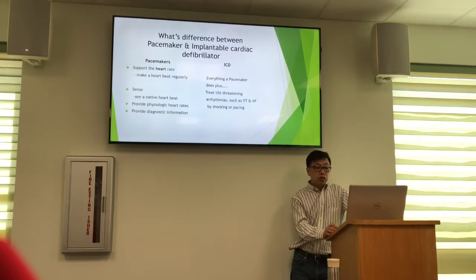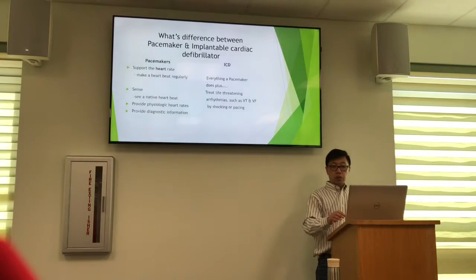If it's sensing dangerous rhythms such as ventricular tachycardia and ventricular fibrillation, it will deliver a shock to reset your heart rhythm. The treatment is called defibrillation. And an ICD can help control life-threatening arrhythmia, especially those that cause sudden cardiac arrest. In other words, heart attack.